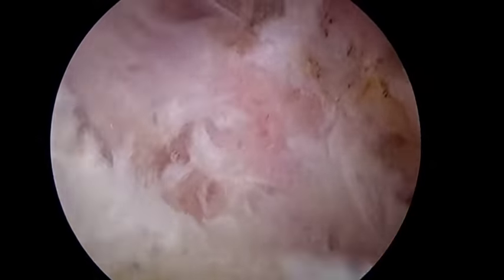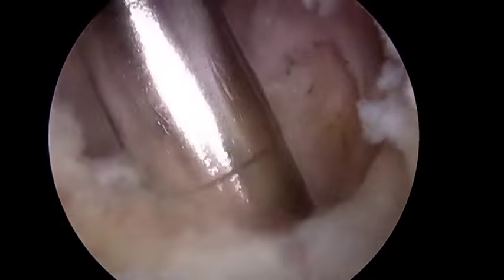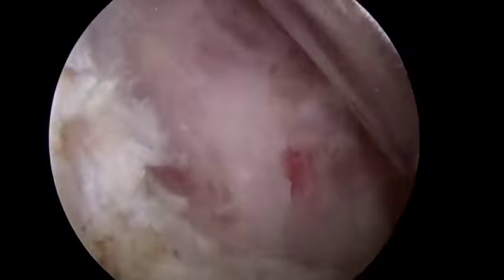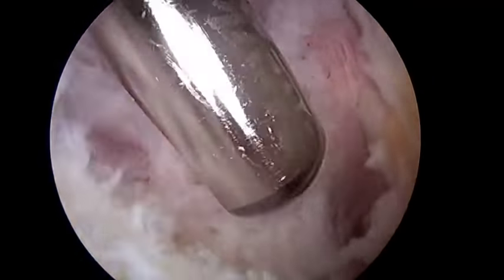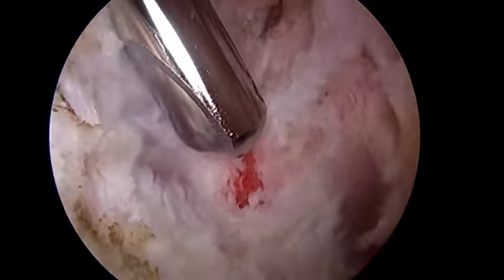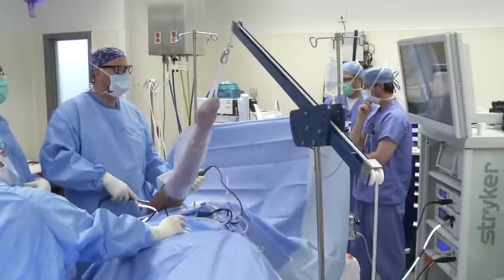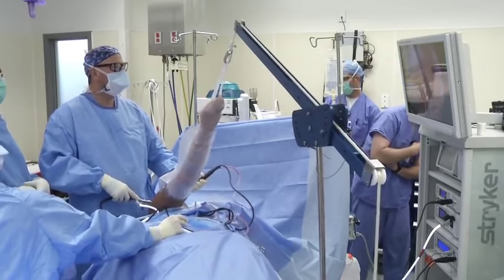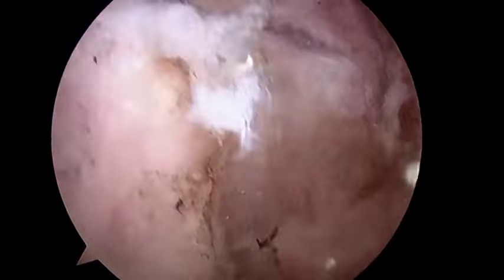So here's the end of the arthritic acromion, clavicle, excuse me, right here. So we're going to identify that and clean some of this junk out, which is just scar tissue. And so here's the end of the clavicle, right here. So we're releasing a little bit more tissue.